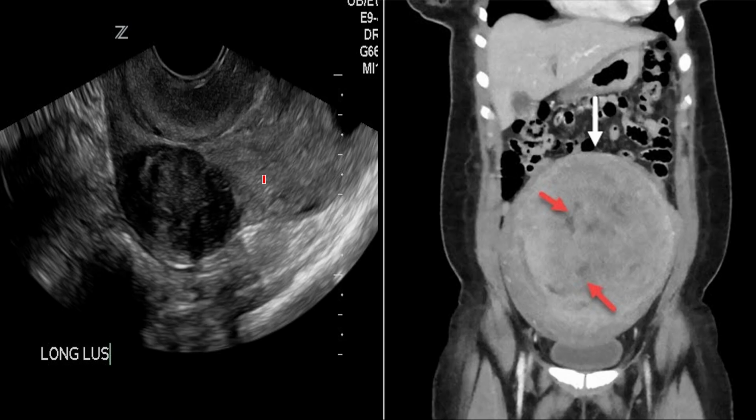Okay, again, most of you are correct. It's fibroids. What you're seeing is a well-defined lesion, discrete, hypodense, or it looks dark. And the one on the CT scan is, again, a large fibroid. Whenever fibroids get so big, it usually causes degeneration. It can be cystic degeneration in this case. It can be red degeneration. It can be calcific degeneration, other things as well.